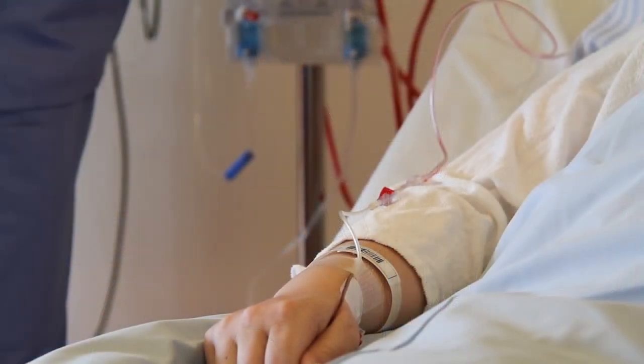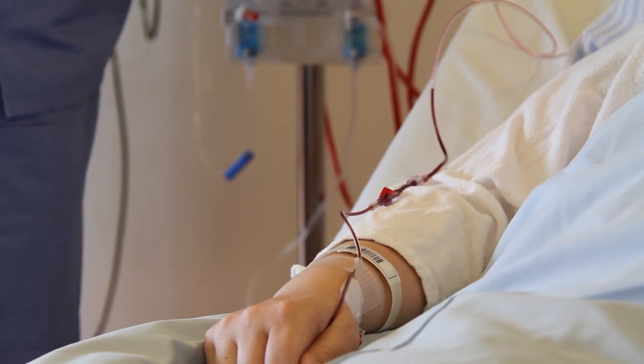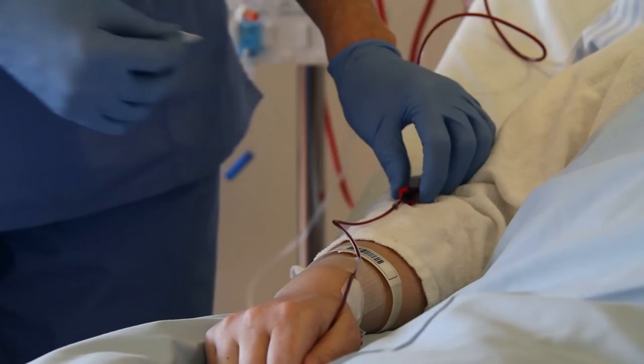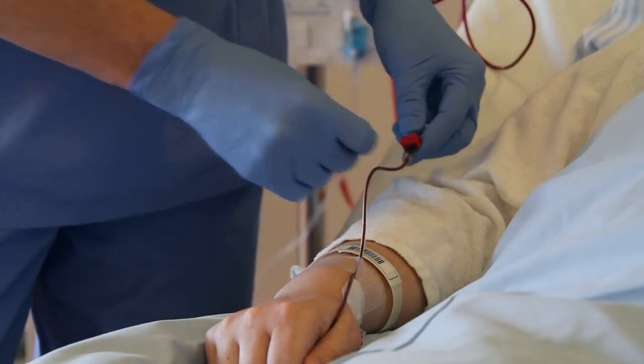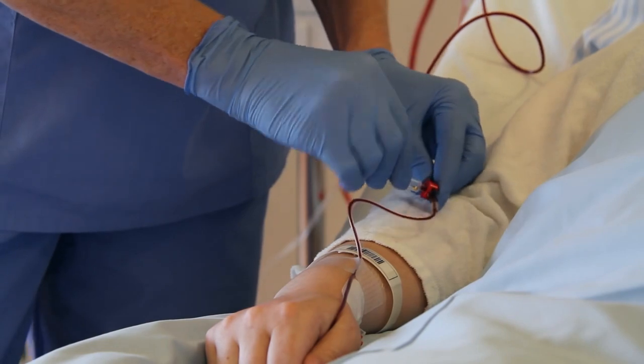Check that the arterial line is functioning properly. Then remove at least three times the dead space from the arterial line. Clean the arterial line sampling port. Attach the blood gas syringe to the sampling port and collect the sample.